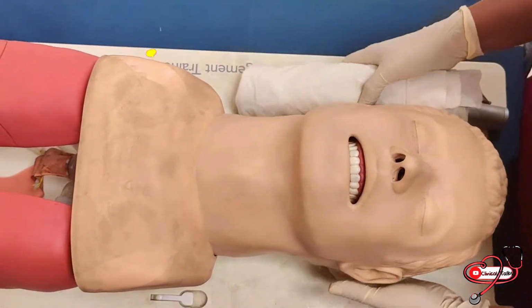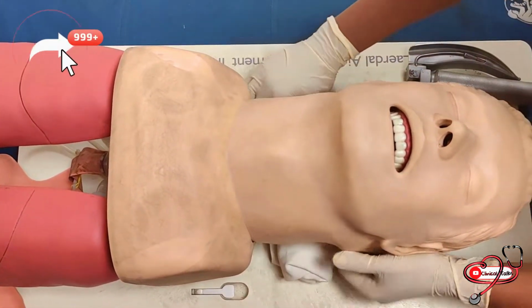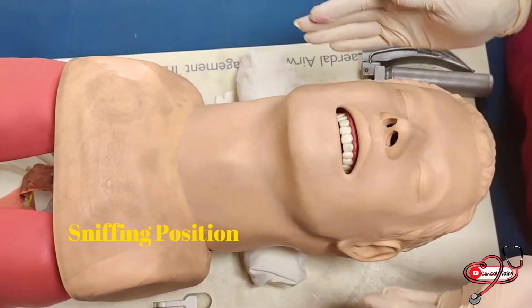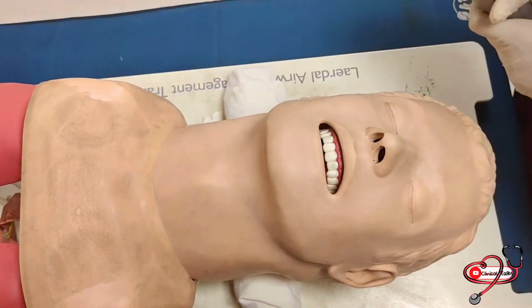So this is the time that you need to give a proper position to the patient. You can give a small pillow or a rolled towel under the neck, so that this position, the sniffing position, enables us to view the vocal cord very clearly. So now we'll start with the intubation.